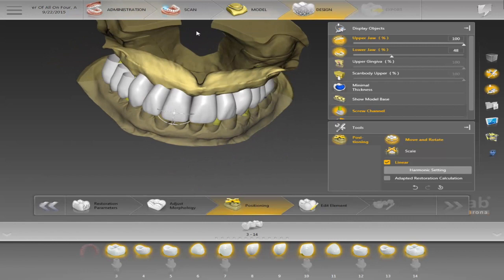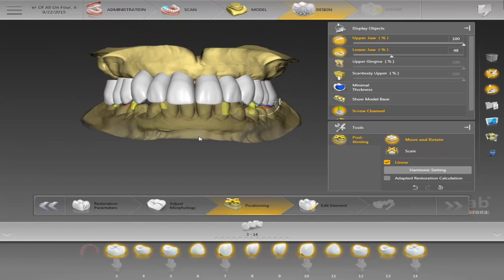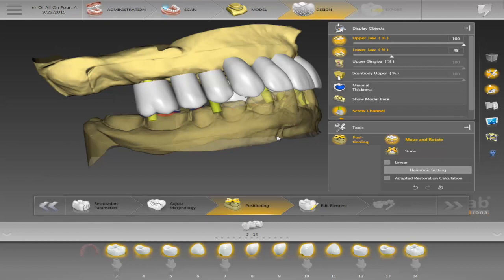Once I bring it into occlusion I can move them individually or in groups by holding down Ctrl — maybe six at a time, the anteriors, bring them down, teeth 8 and 9, whatever I want. Once I click Escape it will ungroup them and I can move them individually into position. It's like we're setting up a denture — we can actually do dentures in InLab 18 as well, but that's for another step-by-step.